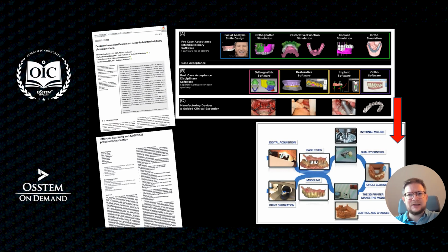What I mean by clinical software: clinical software is the software we are using as clinicians, as doctors, to analyze the patient data, make the project for the treatment, and also to design the devices which we are using afterwards during the surgery. So this part is clinical software.